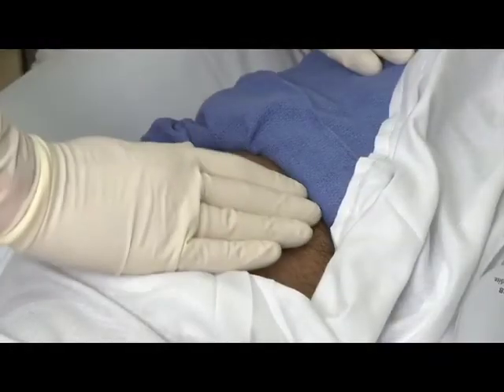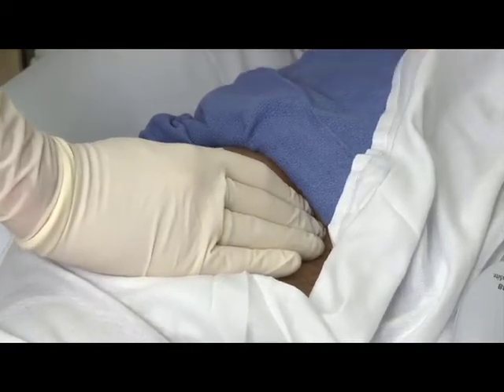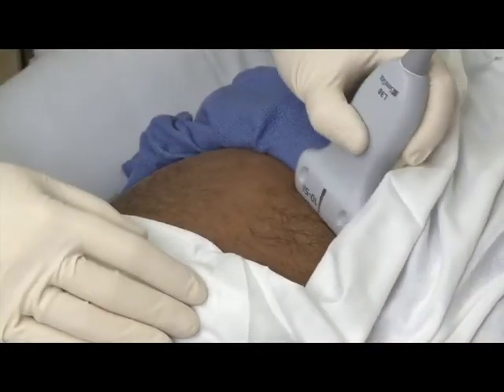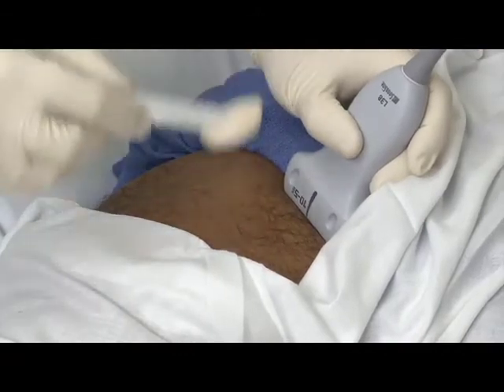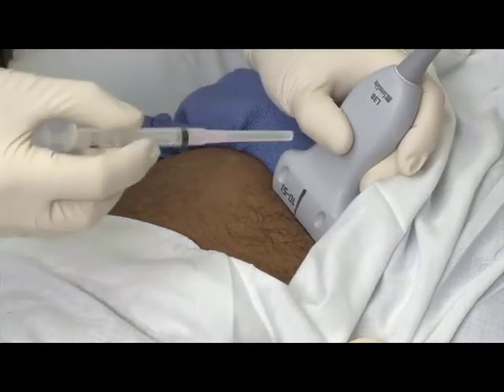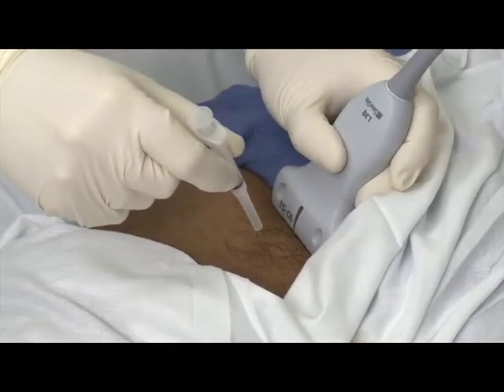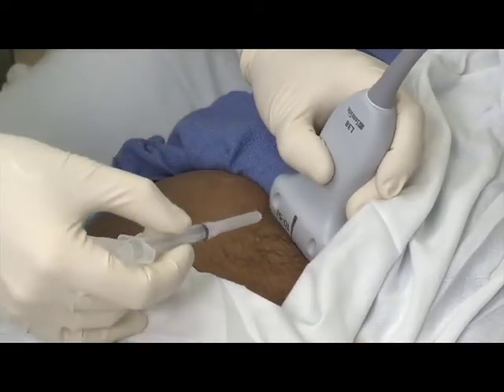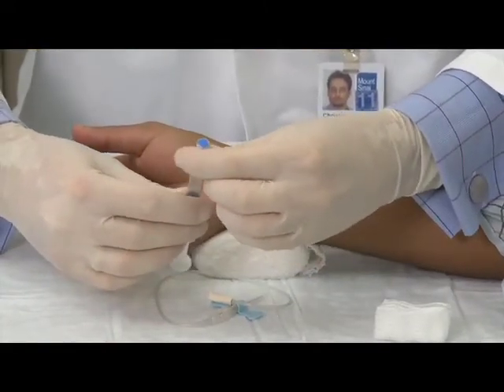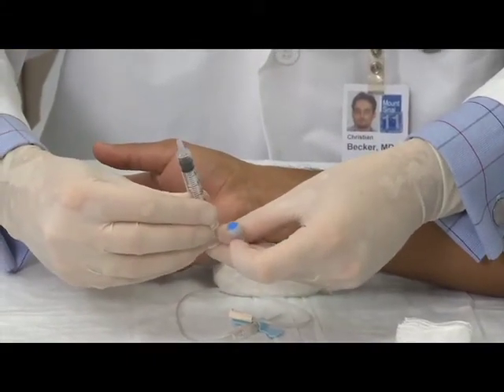Become familiar with the specific ABG kits available at your procedure location. Ultrasound guidance may be used in addition to palpation or when palpation is difficult to guide arterial puncture. When using ultrasound, take great care not to contaminate the disinfected intended skin puncture site with the non-sterile ultrasound probe. Check for functionality of all pieces of equipment. Break the seal of the heparinized syringe to ensure easy movement of the syringe plunger. Leave a small empty volume in the syringe.